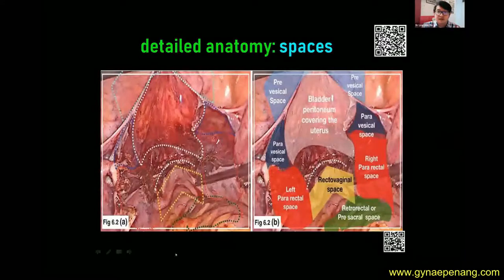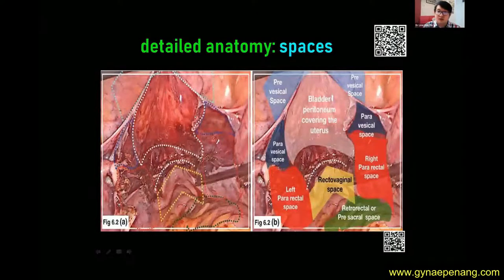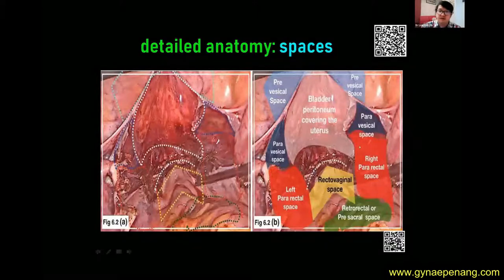Okay, this is a true intra-op picture. Here in front is the bladder, the back is the rectum, and the side is the ureter, vessels, and nerve. So when you look at a lot of surgeon videos later, they will talk about the pararectal, the paravesicle, and you'll get a bit lost about where the paravesicle and pararectal spaces are. Actually, the naming of the spaces is very simple. You can see here, this area is supposed to be the uterus, but it's already cut off, and this is the vagina.